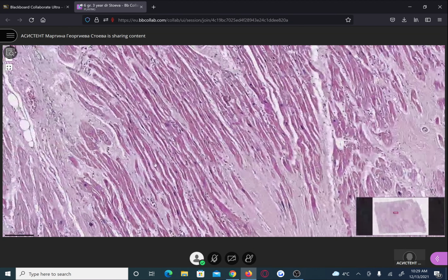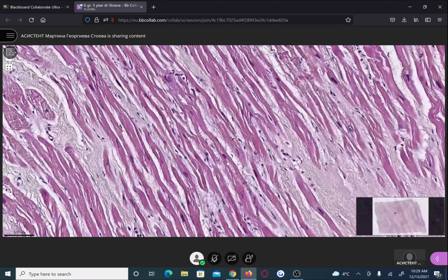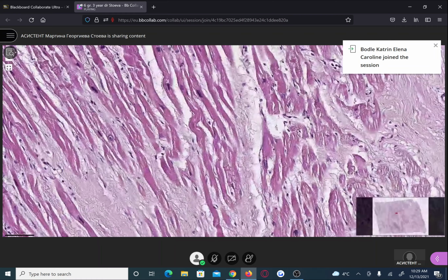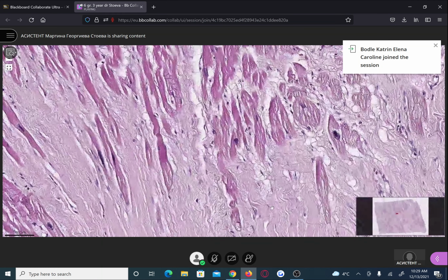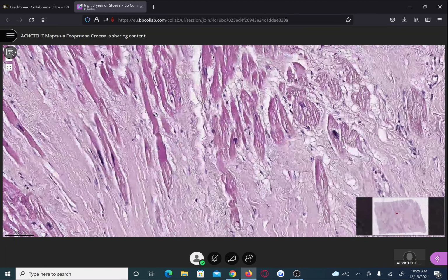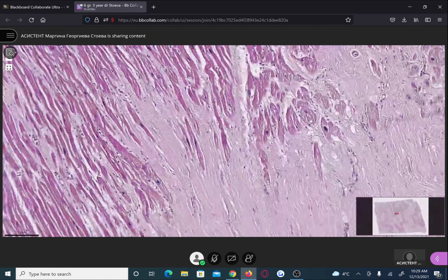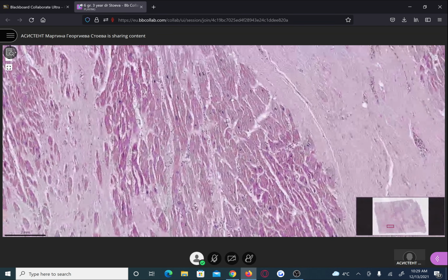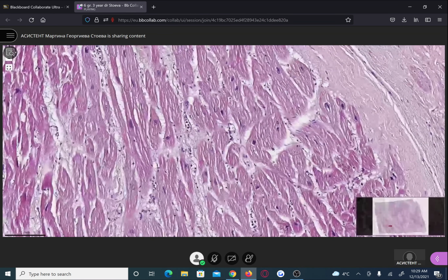Note that there is no fresh necrosis on the slide. These cardiomyocytes are normal. Even in some of them, especially next to the fibrotic area, some of them are highly hypertrophic. Here again. But all of them are still alive. They do not show features of necrosis. Really doesn't matter where you zoom in, you can find the same things. Cardiomyocytes with hypertrophic changes.